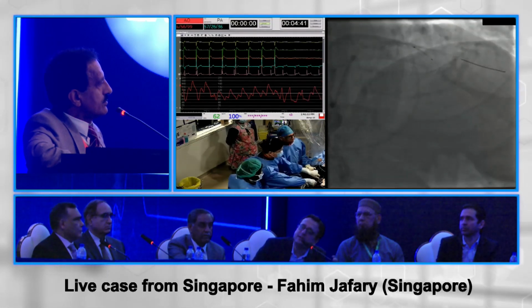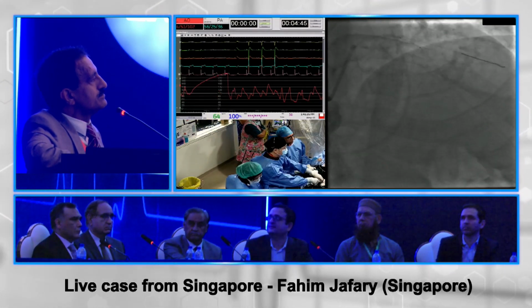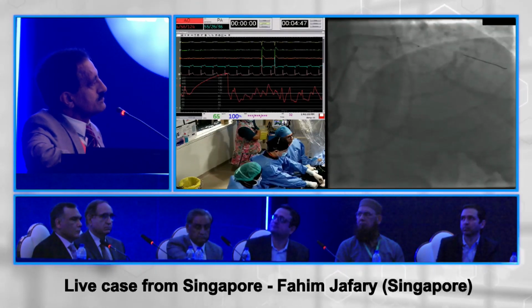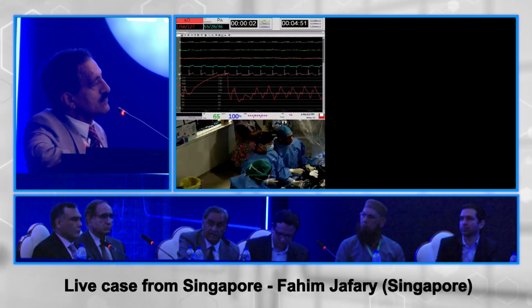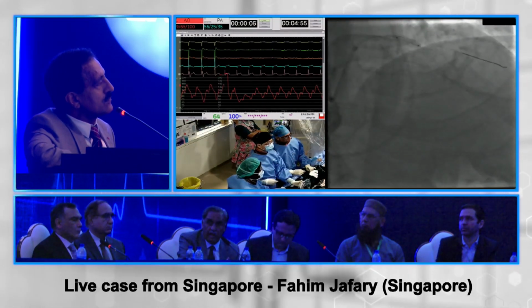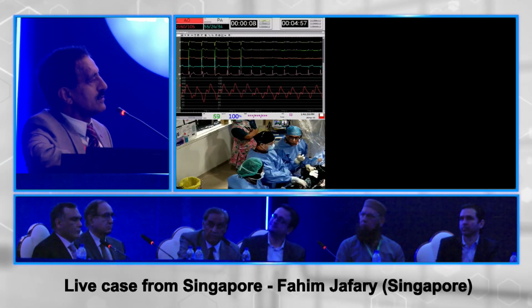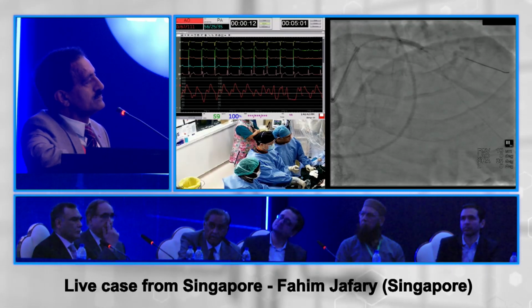And what about combining it with rota at this stage, not just an isolated cutting balloon? Okay, yeah. So let's whack it here. How many times have you come across complications as far as using a cutting balloon? Have you ever got stuck with the calcium, and the blade stuck there, and had a problem pulling out the balloon?